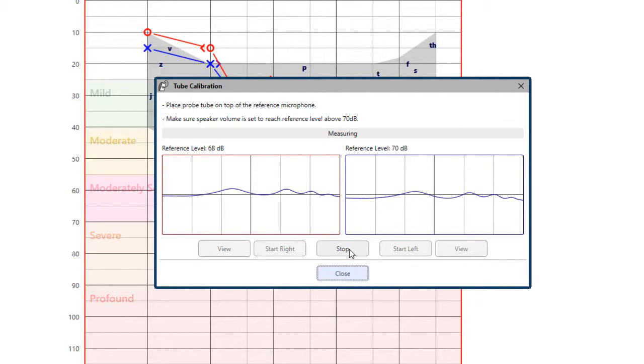The signal must reach at least 70 decibels to complete a valid calibration. If the screen prompt indicates that the signal is too low, either increase the volume of the speaker or move the patient closer and restart the calibration.